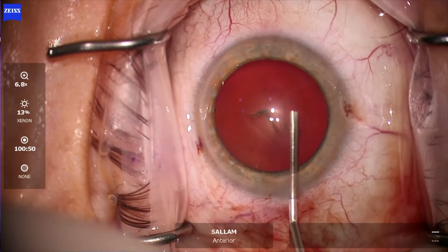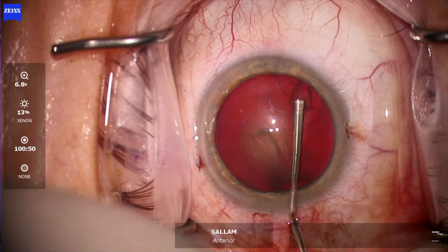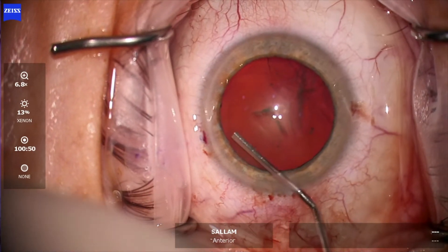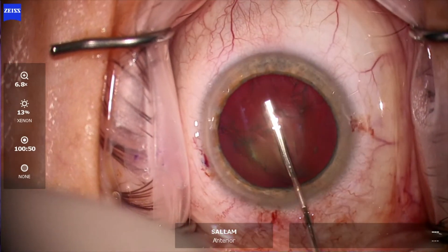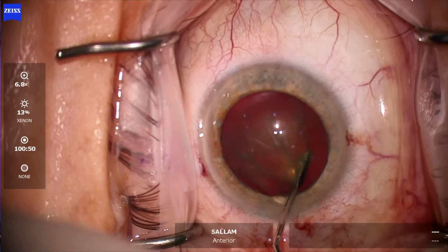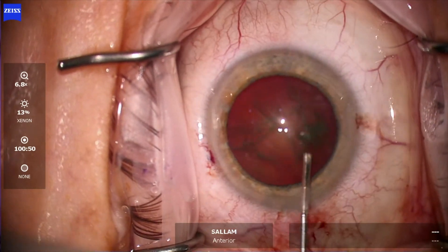Now hydrodissection — going under the rhexis for a good distance, lifting the tip and dropping the heel. This side did not go well; the other side goes well. We have a complete wave — press on the lens, then rotate, and the lens is rotating.